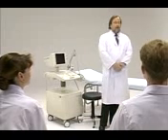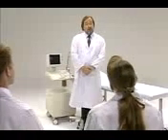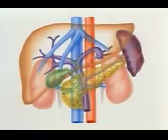Ultrasonography is characterized by the real-time imaging of planes within living soft tissue, which could not be visualized previously. Ultrasonography is painless, non-invasive, and cost-effective. Thanks to these advantages, ultrasonography has become the preferred modality for a wide range of abdominal screening examinations. Ultrasonography is especially effective in evaluations of the liver, gallbladder, pancreas, kidneys, and spleen.